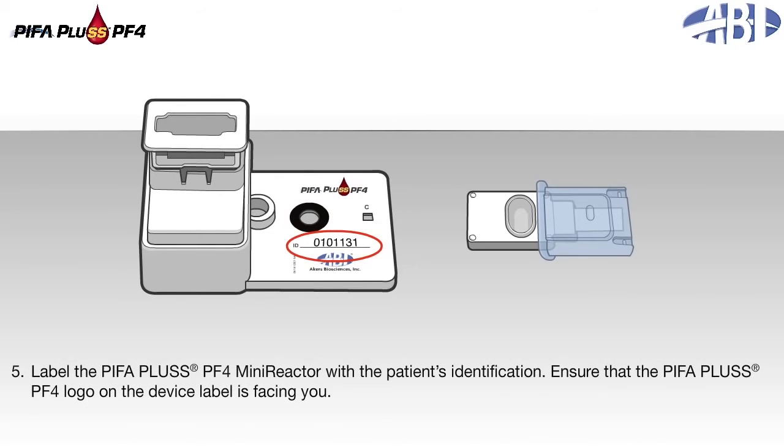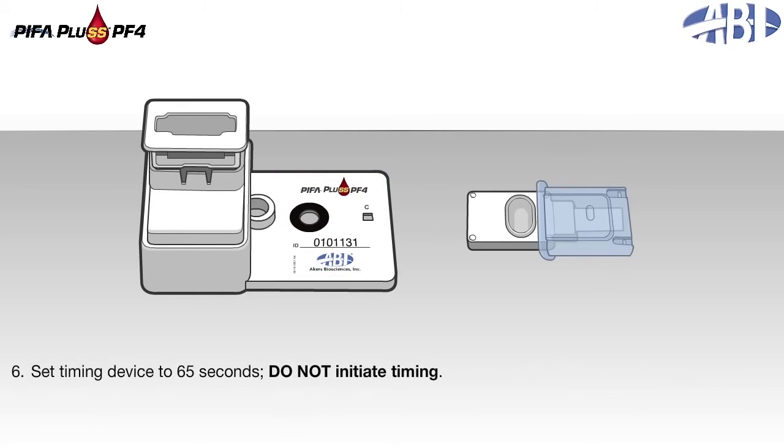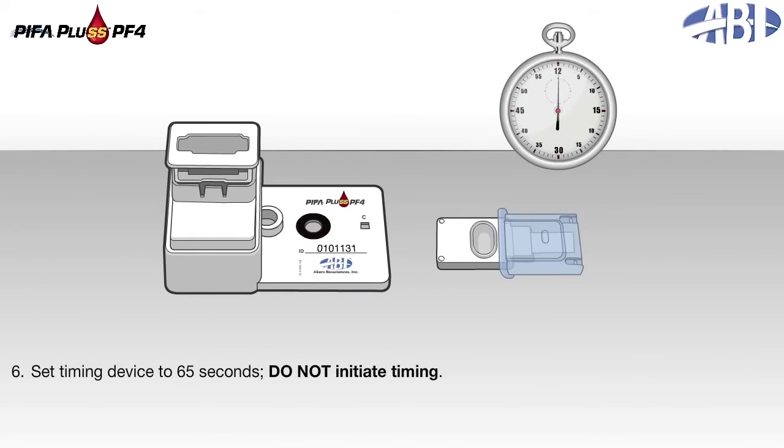Label the PIFA Plus PF4 mini-reactor with the patient's identification. Ensure that the PIFA Plus PF4 logo on the device label is facing you. Set the timing device to 65 seconds. Do not initiate timing.